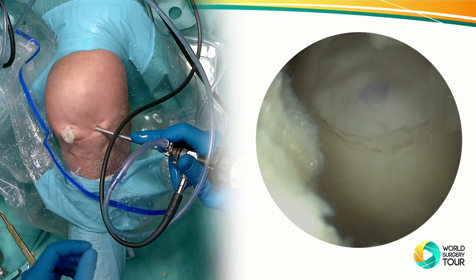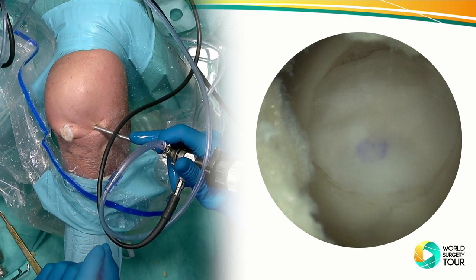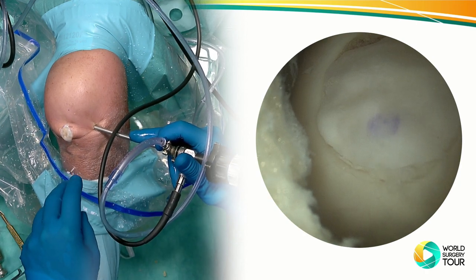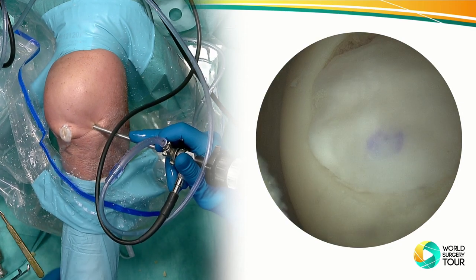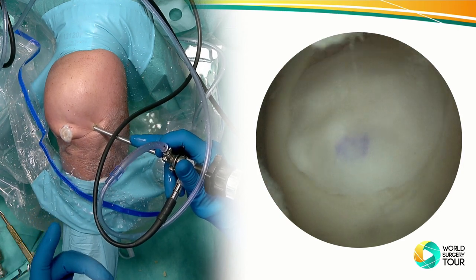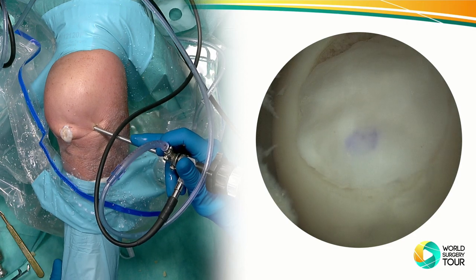Again, adding the minced cartilage adds a little fiddly part to it. But I think it's really important that right before you apply it, you apply the fibrin glue. We did it before, then I did the microfracture. Maybe that already allowed the fibrin glue to not be as gluey as you wish. So that is one thing. The other issue, as you just saw, is that it is important that you remove the water so that the glue can really apply to the whole thing.